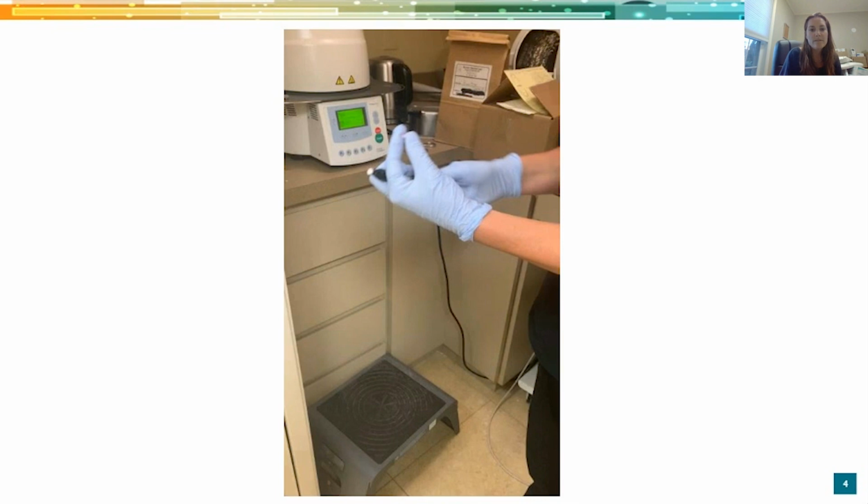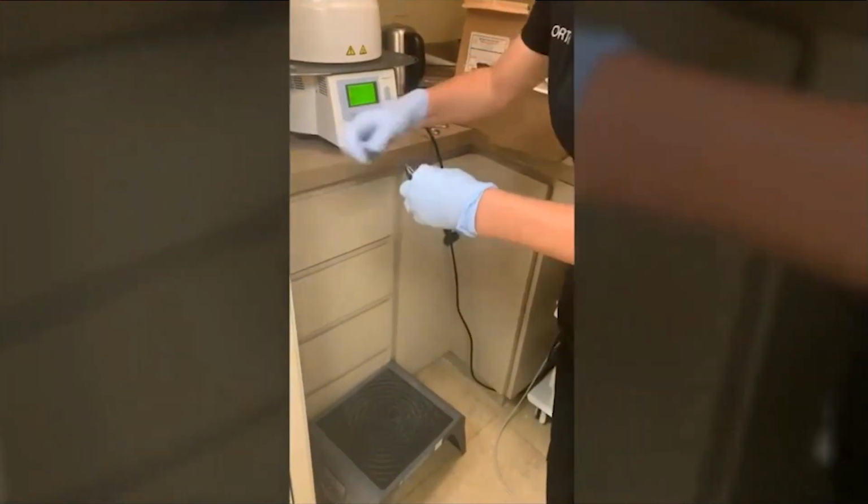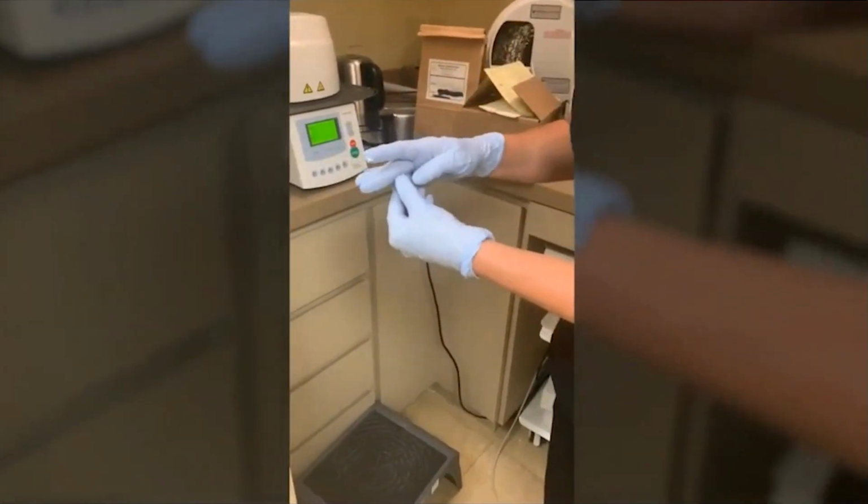And one last video here. So this is it going into the oven. The oven is that piece on the top left. It is closed right now. I always keep it closed because it's at about 550 degrees Celsius.